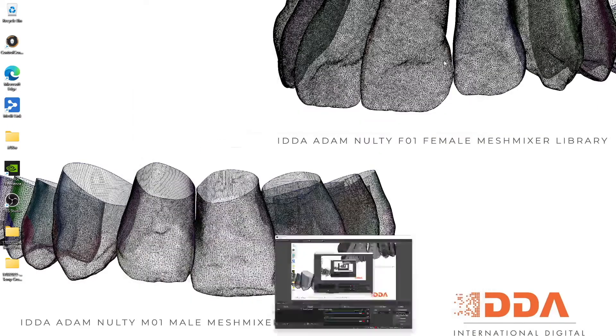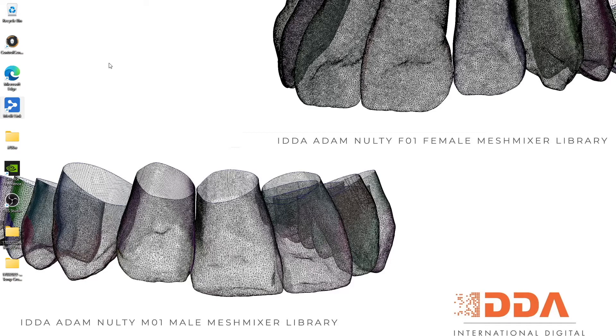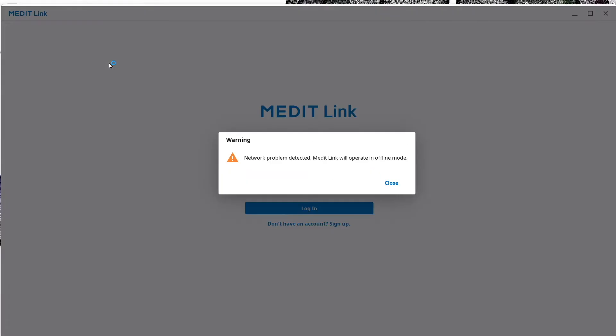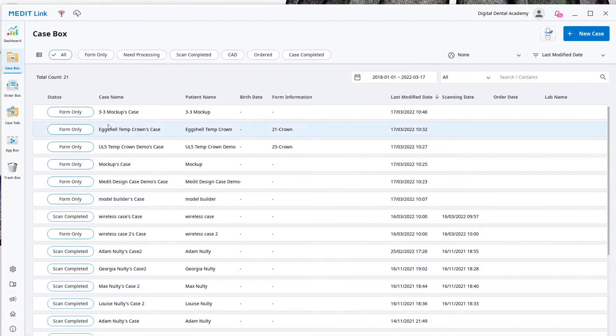Hi everybody, in this tutorial I'm going to show you how to import scans from anywhere, Medit or otherwise, into your MeditLink software that you can get for free from MeditLink.com to be able to use any of their apps.